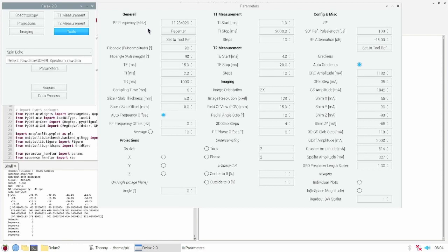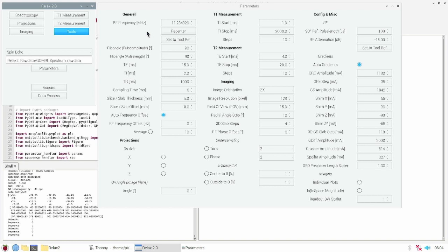After we have found the RF frequency, so the Larmor frequency, we now need to know the 90 and 180 degree condition. For that we need to set the pulse height of the transmit pulse. We do this with the RF attenuation.